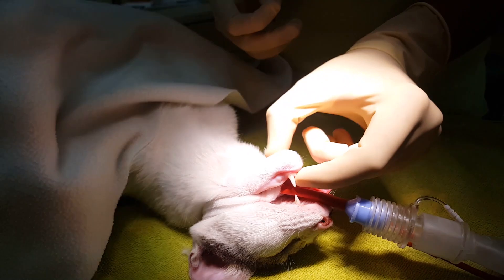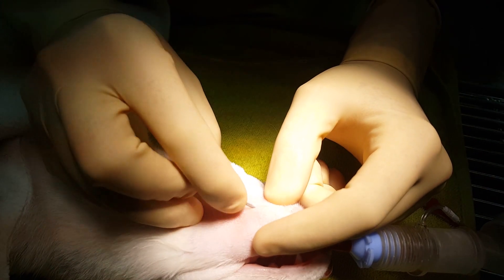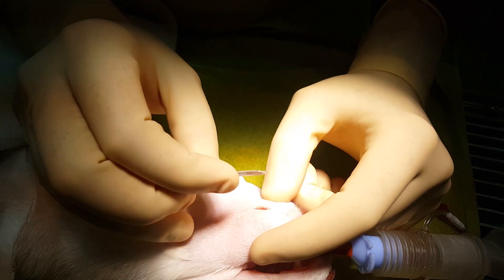Okay, what we're going to do now is this: we're going to make a tiny incision here in the lower part of the chin where the metal wire will come out after we stabilize the jaw.